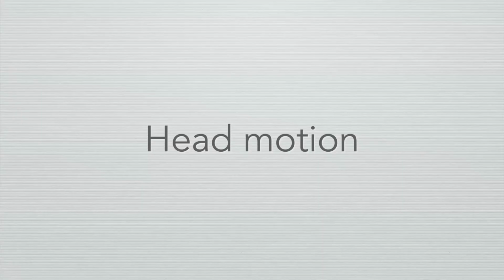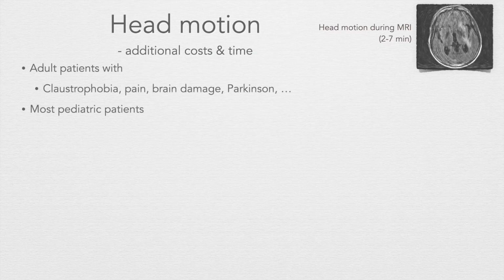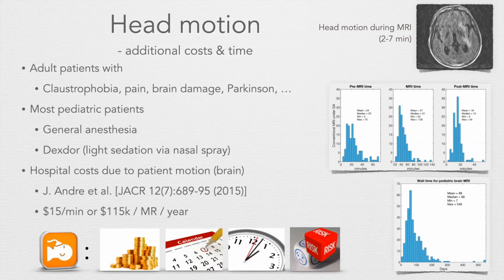Lastly, I'm going to spend 5 minutes on head motion, which is sort of one of our favorite topics. So we know that head motion is costly, and I think here is a famous paper from Jalal Andre showing that head motion in the clinical care costs about $100,000 per MR scanner per year. If you're considering that you need to rescan, you need to reschedule, and some of these have to come back with anesthesia and so on.